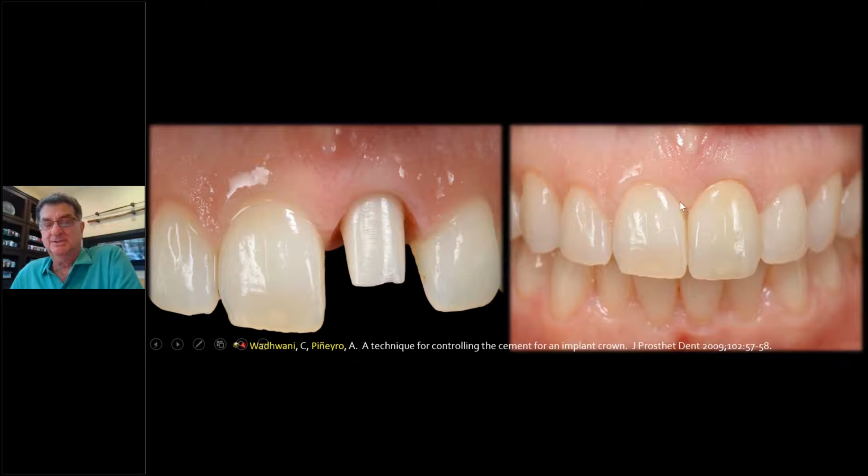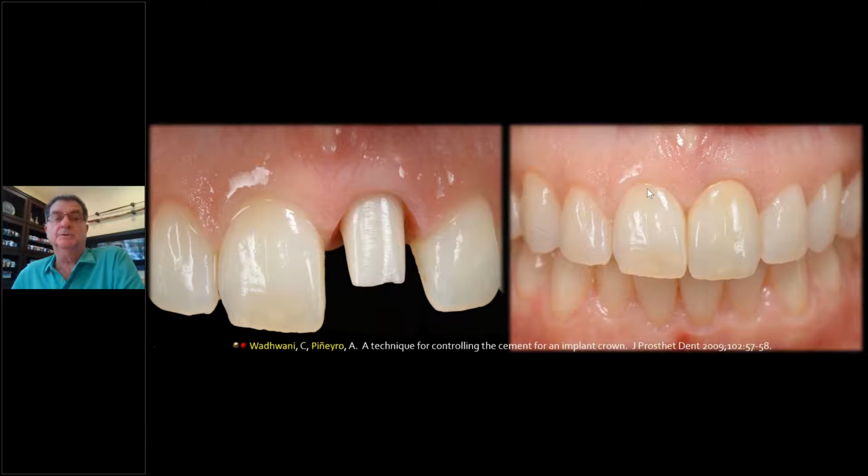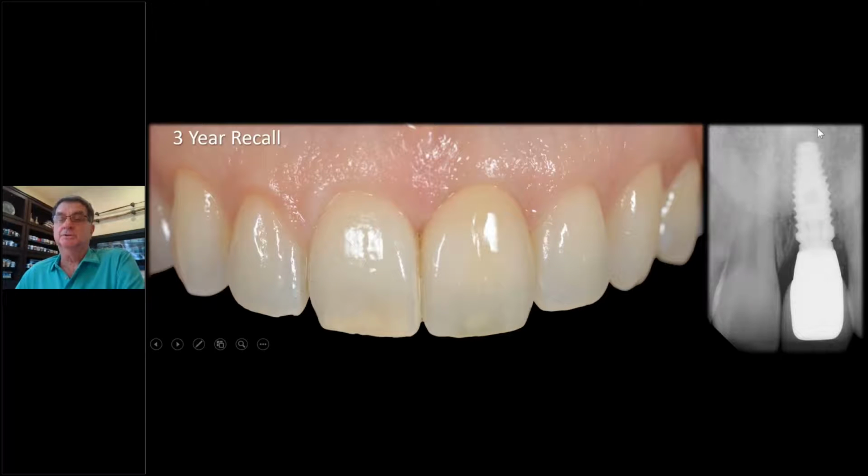As you see, this is thin scallop tissue. And I think you agree that we have a very nice result, and that's what we see. And here it is 3 years later. So we don't see, and there's the bone, 3 years. And so this is what we tend to see, even on these thin cases. So thin scallop doesn't bother me at all. As long as the buccal plate's present, we're gung-ho with this, and we don't disturb it. We don't disturb the tissue this way, no flaps, and minimally invasive. One surgery, one time. So that's what we tend to do.